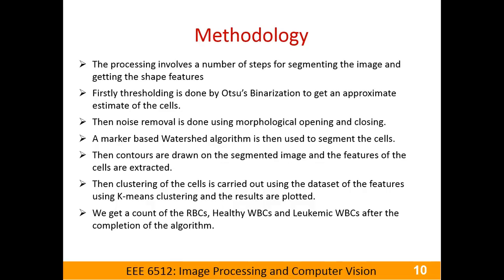So the methodology to do the segmentation involves a number of steps for segmenting the image and getting the shape features. Firstly, thresholding is done by Otsu's binarization to get an approximate estimate of the cells. Then the noise is removed using morphological opening and closing.